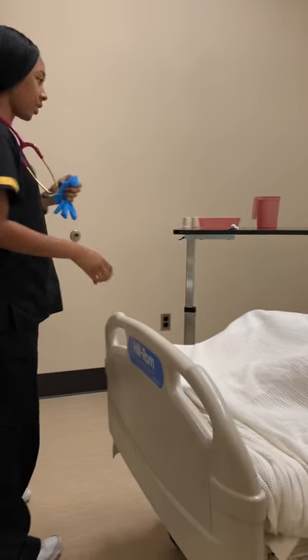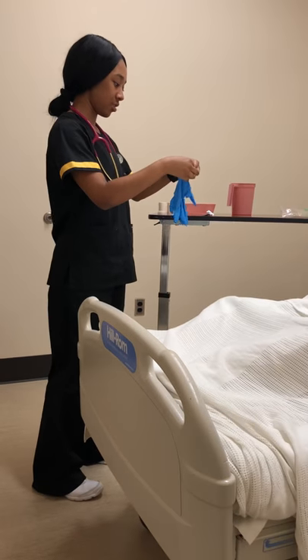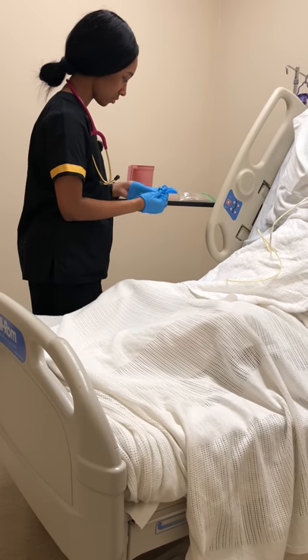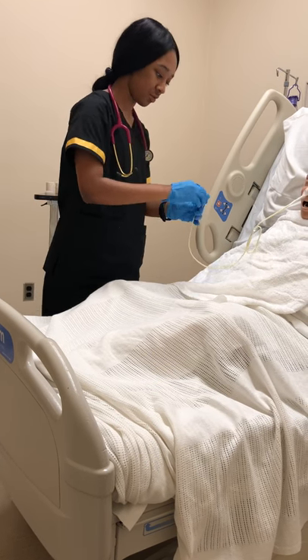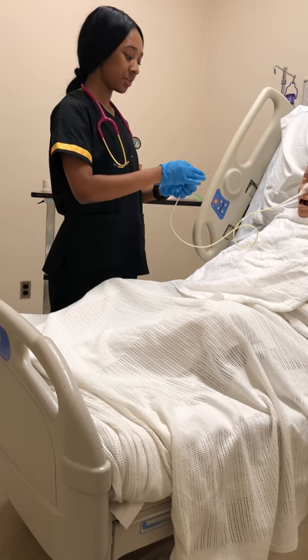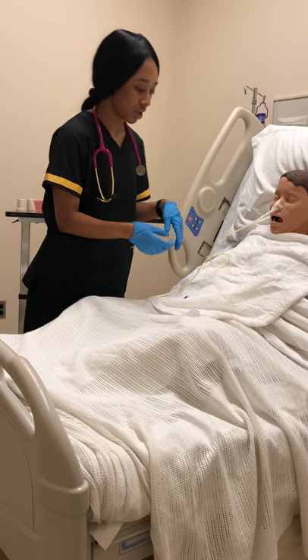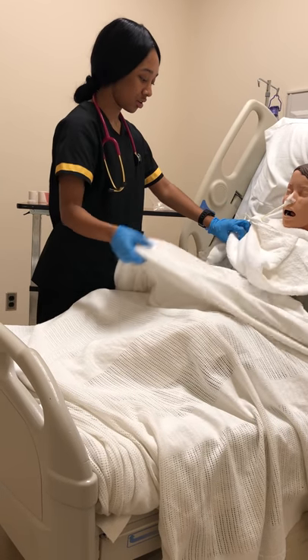Hi Ms. Johnson, x-ray did confirm the placement of your NG tube, so we're just going to start your feeding. But before I do that, I'm going to remove the wire from your tube. Okay, I'm going to remove the wire and then I will start your feeding. And then after the feeding, the doctor has ordered the removal of the tube, so I'm just going to start that by checking the bowel sounds of the patient.